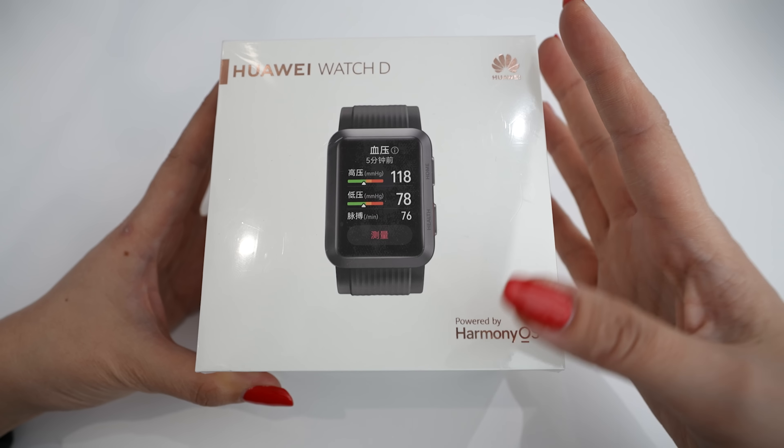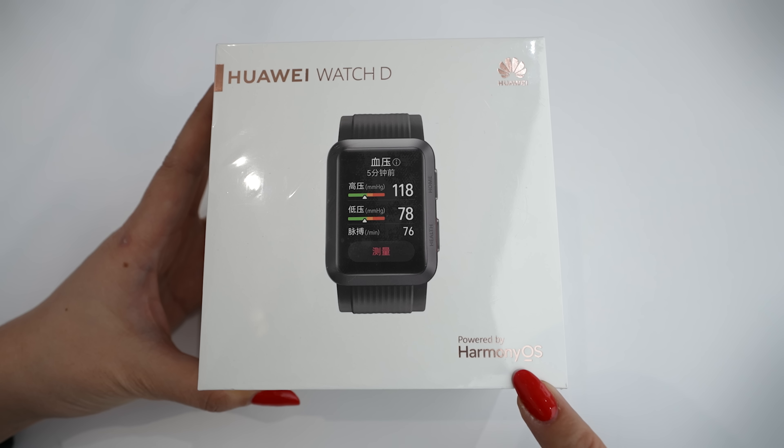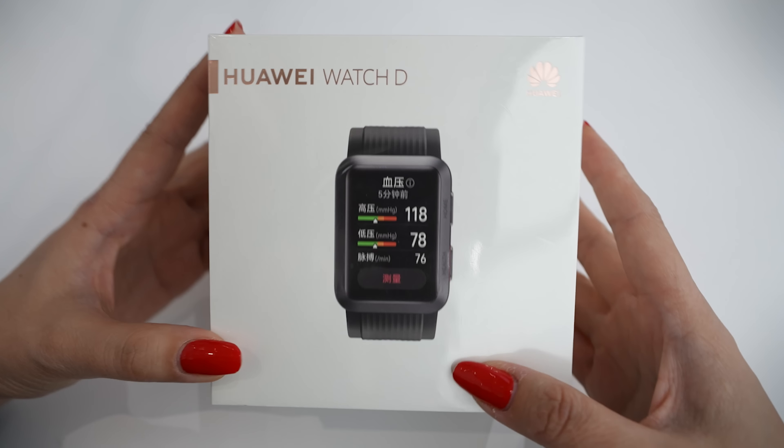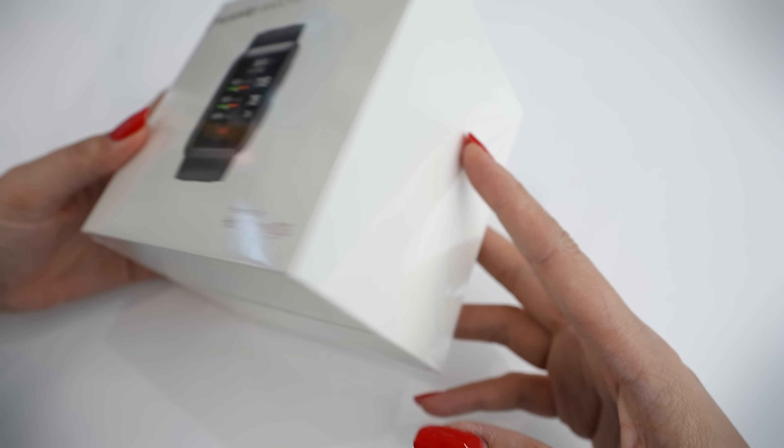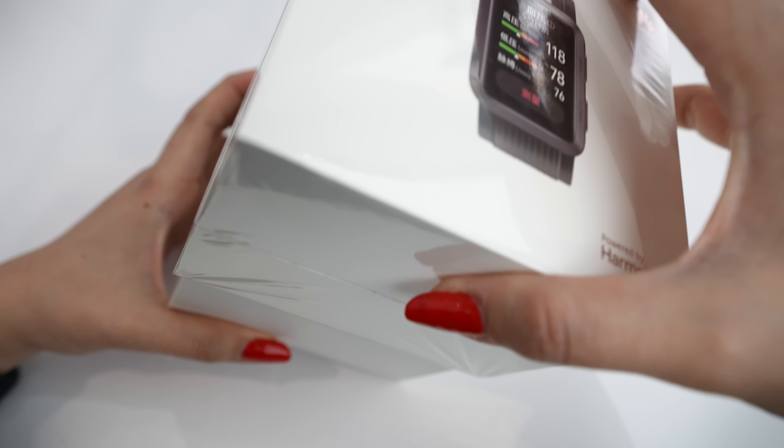Well guys, this is our Huawei Watch D, and you can see that it comes with the HarmonyOS system. It's a simple box — brown from all sides — we just have a photo of the screen here in the front. Let's open it to see how it is.